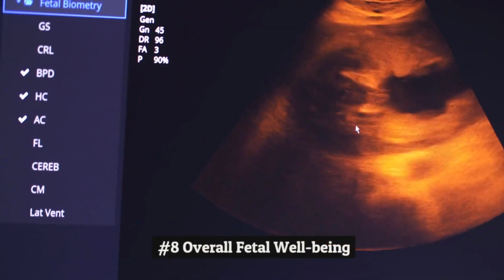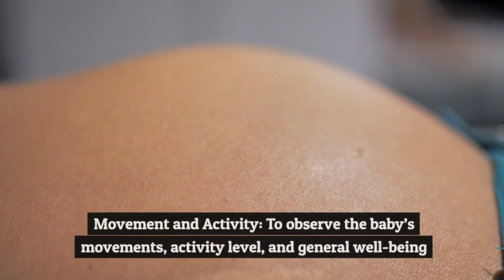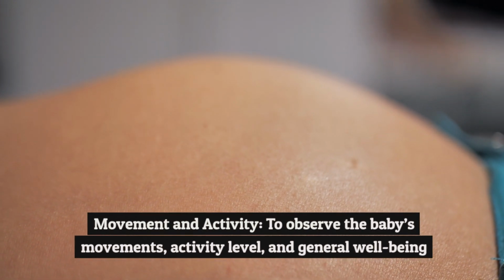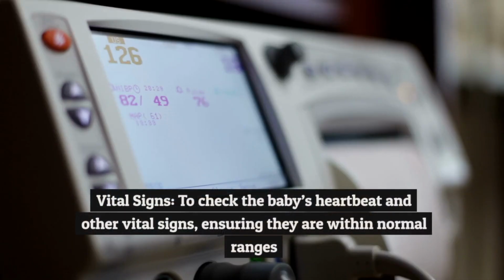Number 8, overall fetal well-being. Movement and activity, to observe the baby's movements, activity level, and general well-being. Vital signs, to check the baby's heartbeat and other vital signs, ensuring they are within normal ranges.